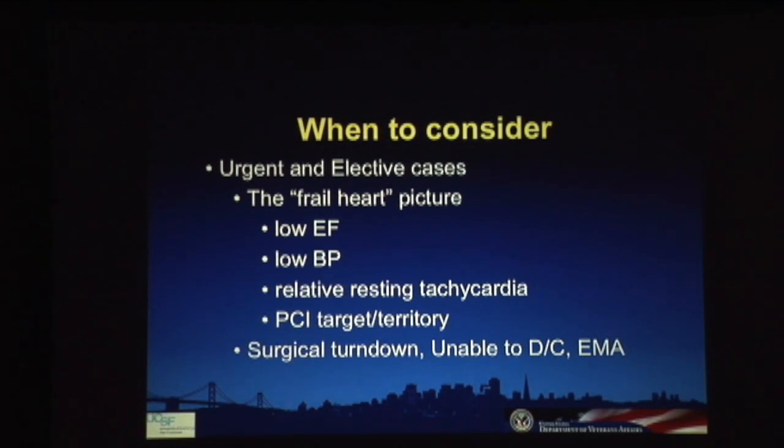And then the territory is very important. I think that was a great case that Mazen showed, of opening the right coronary to facilitate being able to do a left main and LAD without support. I think that's a tremendous example of how you can make a case safer. But it's the ones who have a territory like a left main with the right occluded, that sort of thing, where you want to really think about it.